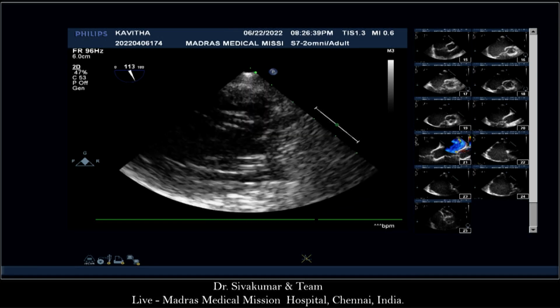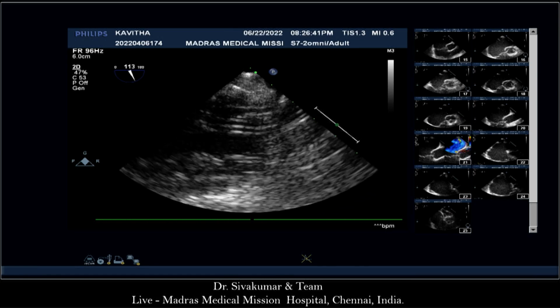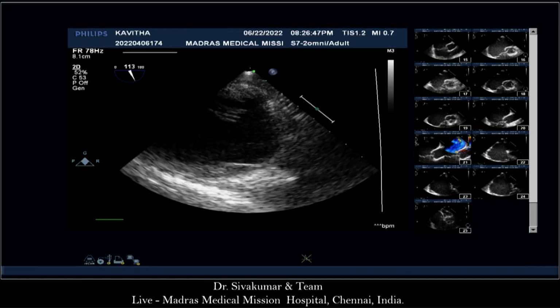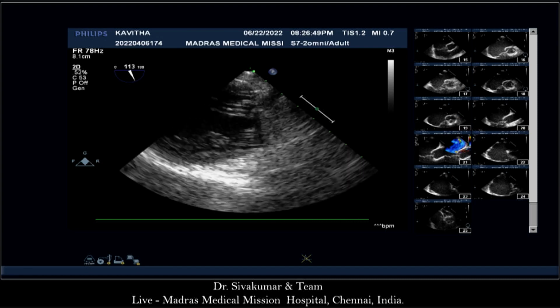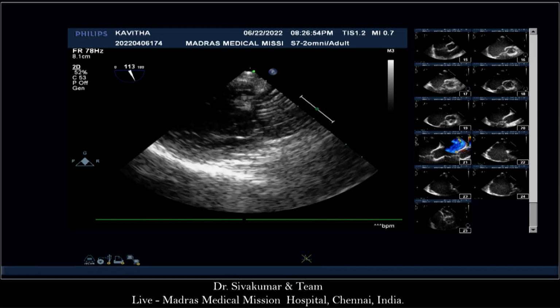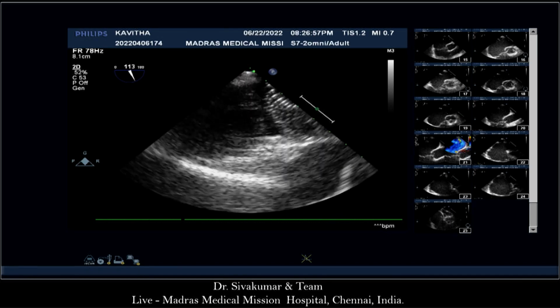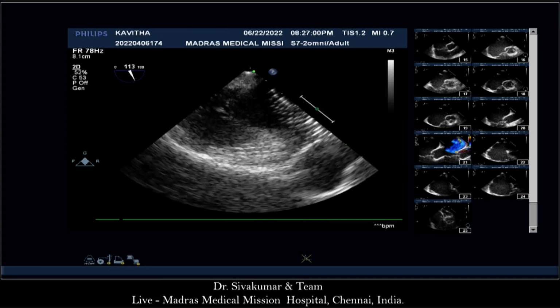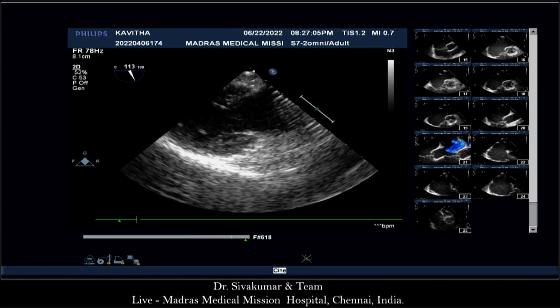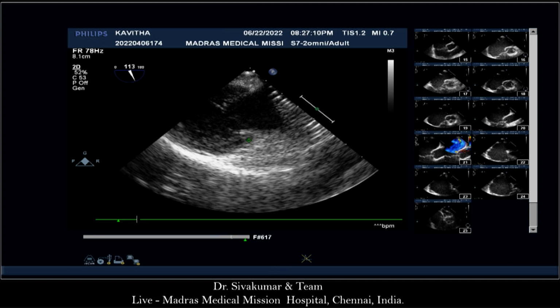So this is the left ventricle in long axis. The picture's almost too big for me. Can you make it slightly smaller? I can't see the whereabouts we are. Thanks, Shiva. This is the mitral annulus. And my device is slightly. That's a very good view, because you do see the reverse of what we would see with the four-chamber view. We got the whole of the disc just above. If you plane it through as you're doing, we'll see how far back it goes. It looks like it's not going to touch. This is the posterior mitral leaflet and the anterior mitral leaflet.